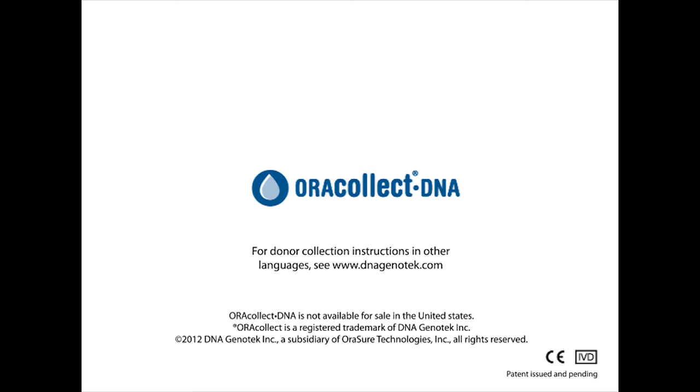AuraCollect DNA is an easy, non-invasive way to collect and stabilize DNA from human oral samples.